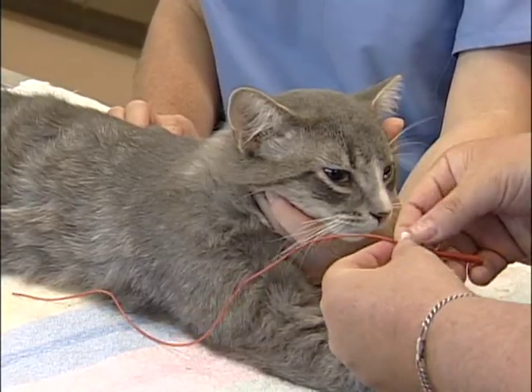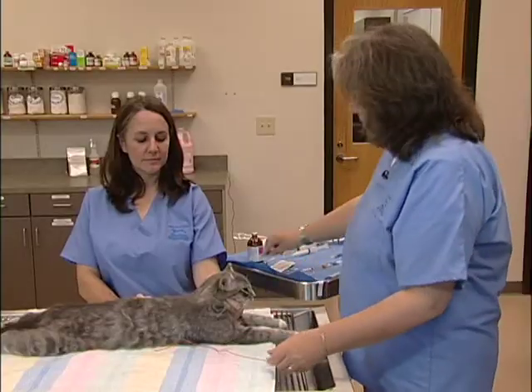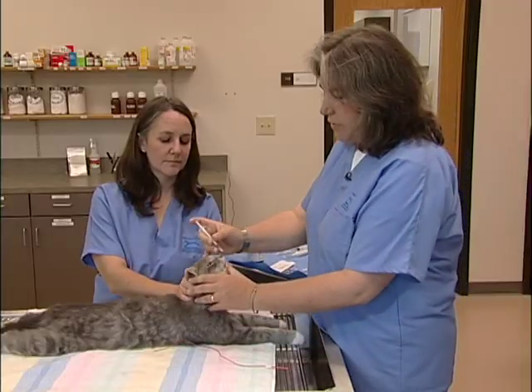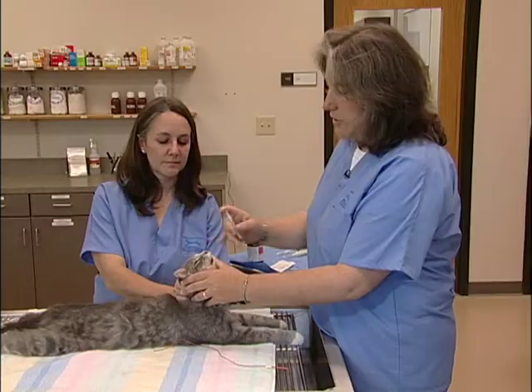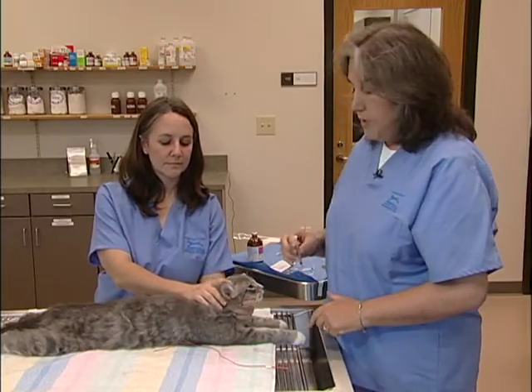I'm going to take a small piece of tape and mark the tube so I don't over-insert it, and I'll use that tape later to affix the tube to the cat's face. I'm going to instill a small amount of lidocaine into the cat's nostril just to provide a little local anesthesia for the procedure. You should wait about 5 minutes after instilling the lidocaine for it to take effect.